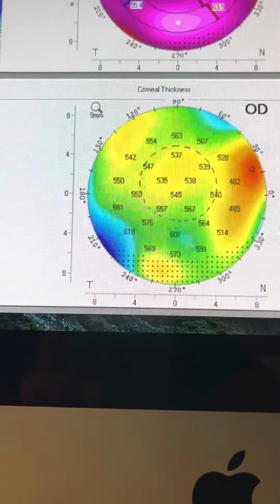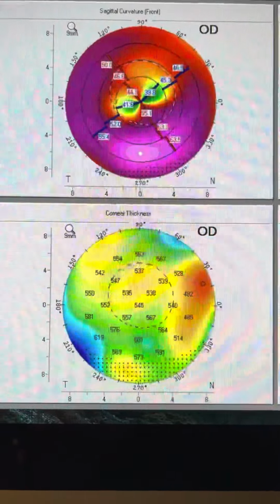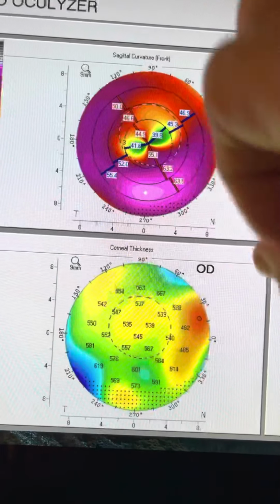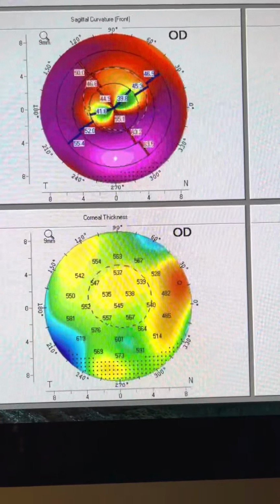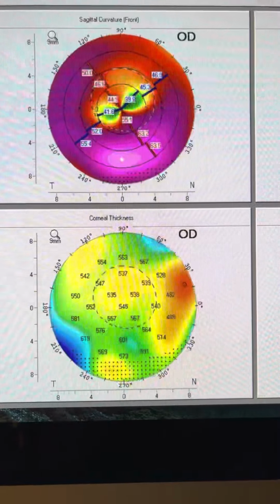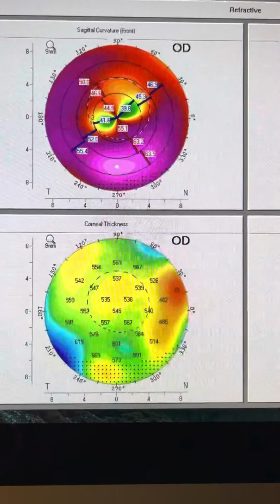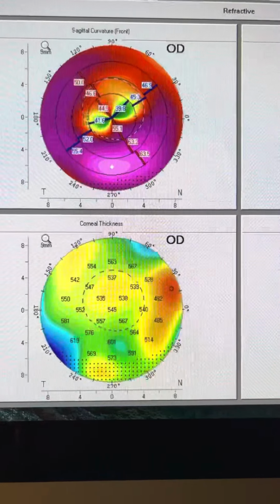So here we're going to use the technique that we've described in many meetings, and it is on our YouTube channel, to re-cut the incision 360 degrees, soak the interface, not a total freeing up of the transplant, but go as deep as possible, almost down to Descemet's membrane with a 15-degree knife manually, and then soak that interface with riboflavin, resuture with interrupted sutures, and then perform an annular flash cross-linking session.